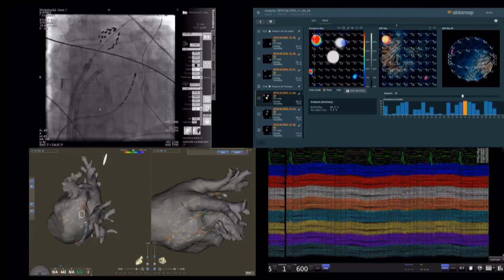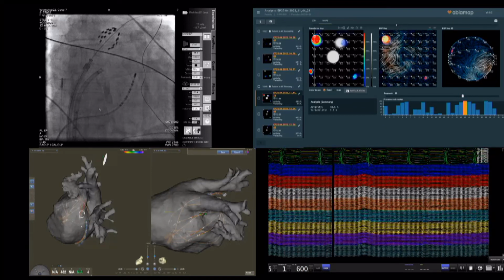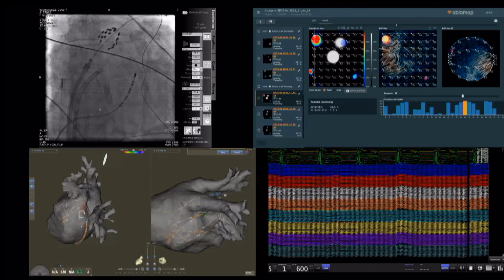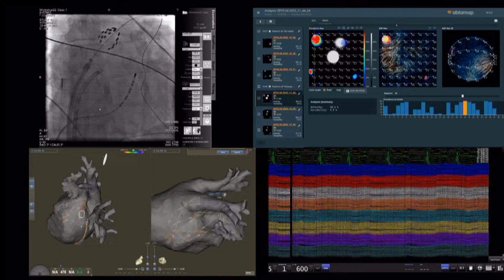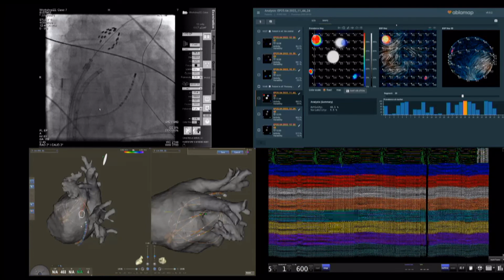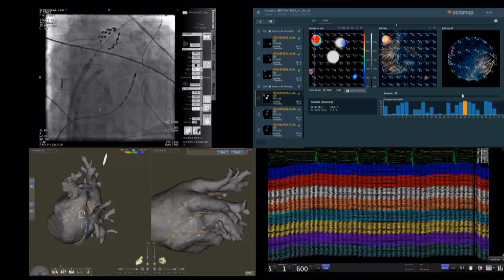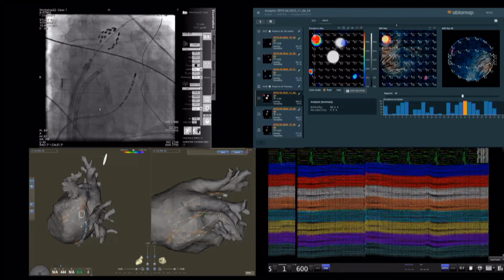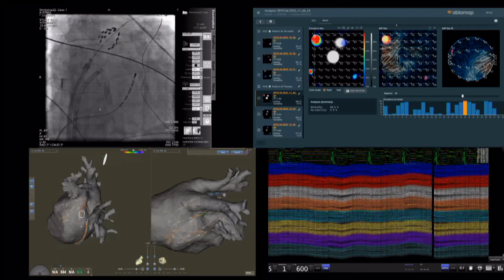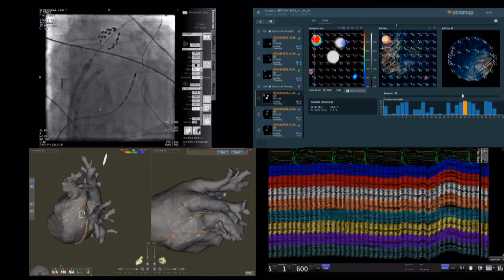So in broad strokes, this is a patient, again, who has persistent AFib, as Pavel said. Our goal here is to isolate the veins and then use EGF mapping to look for residual AF sources, and then we'll try to target those regions, okay? A region or regions. Now, the way we're going to do the EGF, we also did a baseline EGF map, and this is for our interest. Technically, you don't need to do a baseline, but we did a baseline map.